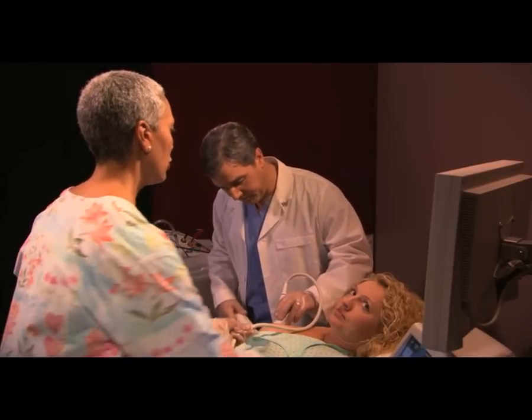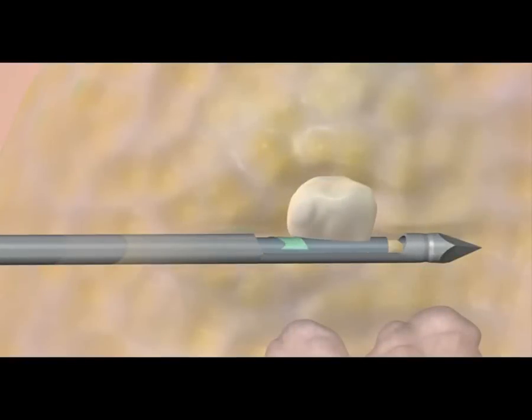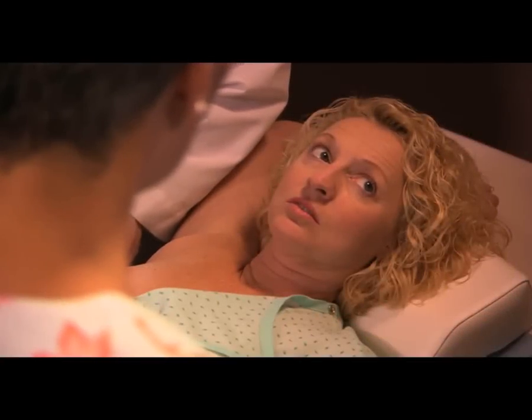Vacuum pressure is used to take out the sample, flushing the area with fluid at the same time. Using the ultrasound image as a guide, the tip of the biopsy device is inserted into your breast, and they begin to take the tissue samples. The biopsy device will be inserted one time, and the doctor will rotate the device to take multiple tissue samples. It may take a minute or two to get the complete sample.